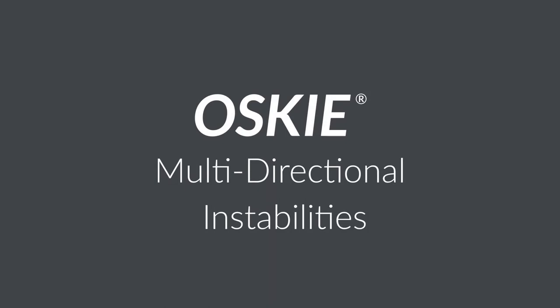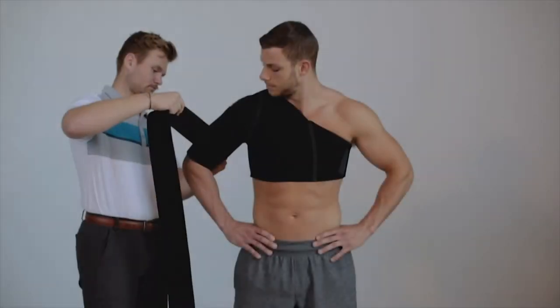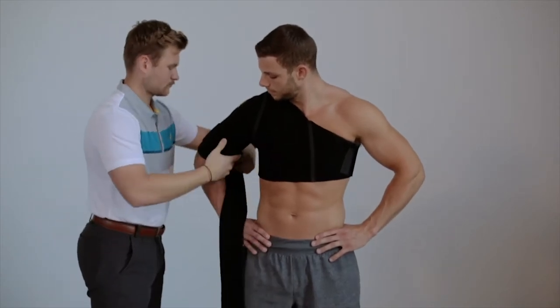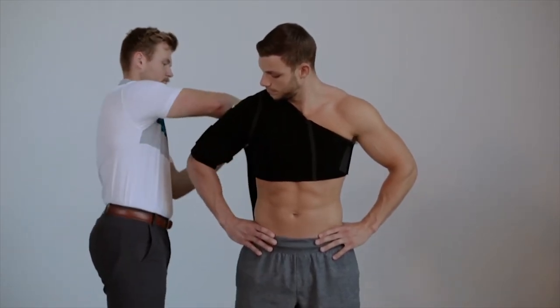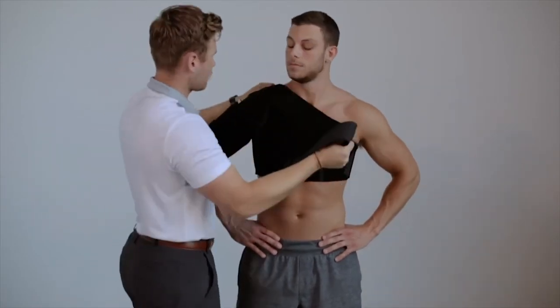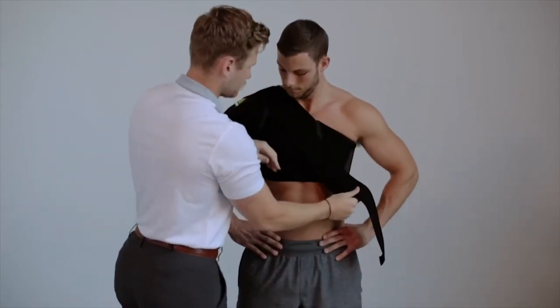Application for multi-directional instabilities: after applying the OSKIE shoulder support, place the hand of the involved side on the hip. Attach the hook and loop end of Strap A to the medial and posterior aspect of the involved arm. Hold the strap superiorly, just distal to the acromion process.